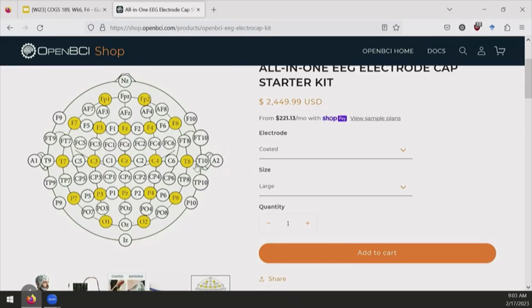One thing that I've recommended to groups who are trying to replicate an analysis is to choose your channels off of what the literature suggests. Or if you actually have a data set, you can say, okay, I want to replicate this, so my analysis team is going to take this data set that has 128 electrodes, and we're going to run analyses to say, if you can choose 8 only from the subset of the 16 we have allowed, what gives us the best performance? And then you can use that. So you can iteratively determine that. Otherwise, feel free to ask us which electrodes make sense.